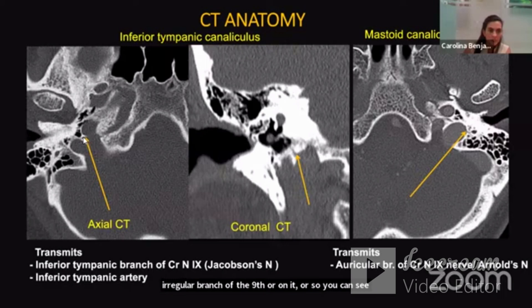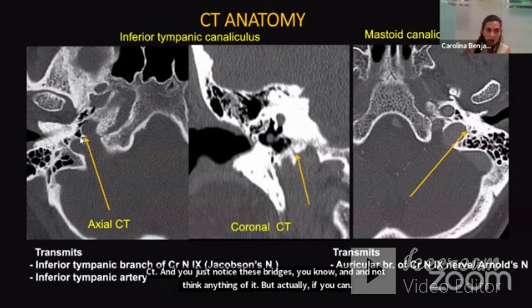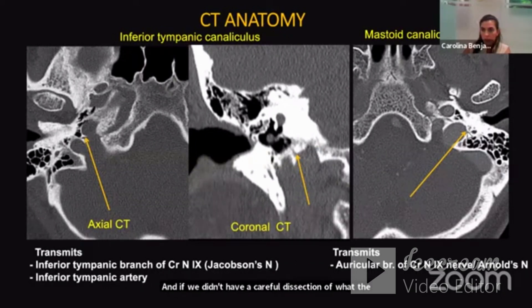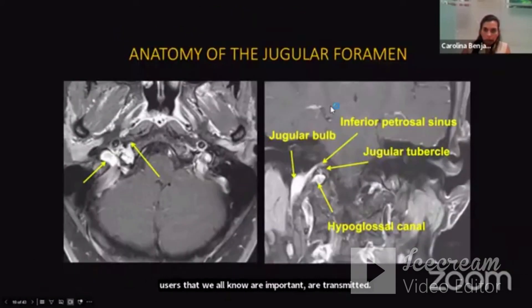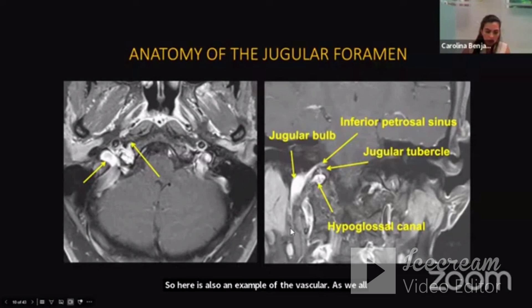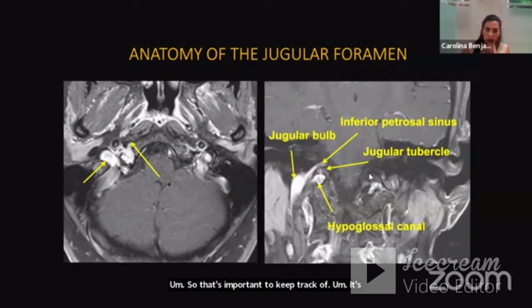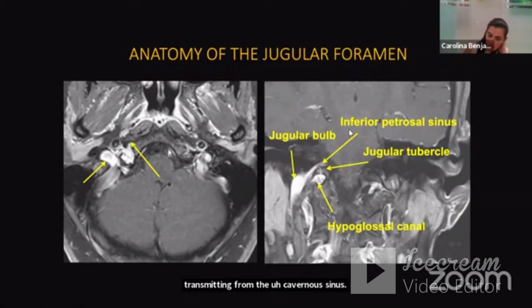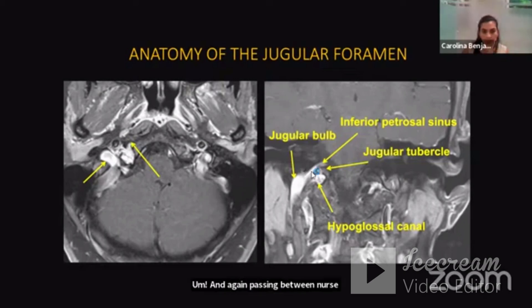If you're not looking carefully, you may notice bridges on CT and not think anything of them. But a careful examination of CT shows the canals through which these important nerves are transmitted. The inferior petrosal sinus drains into venous lakes, eventually emptying into the medial aspect of the jugular bulb, transmitting from the cavernous sinus. It passes between cranial nerve IX anteriorly and cranial nerves X and XI posteriorly, so its medial-to-lateral location in relationship to these nerves is important.